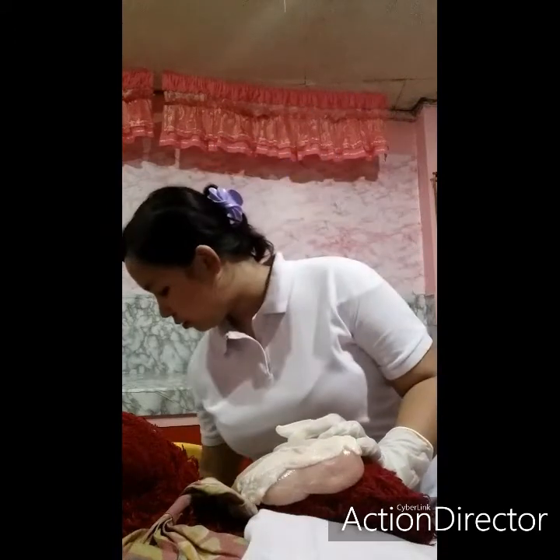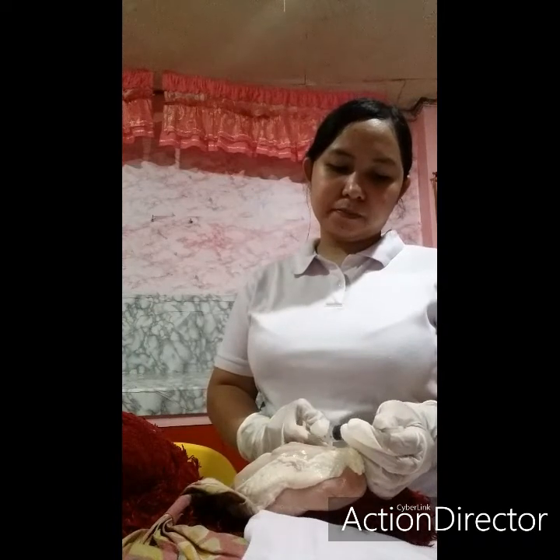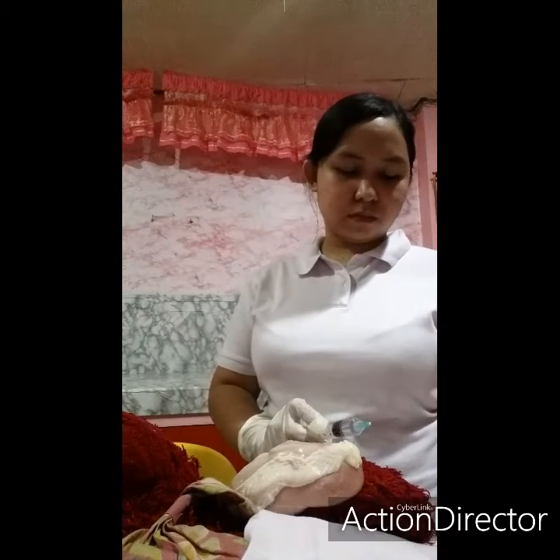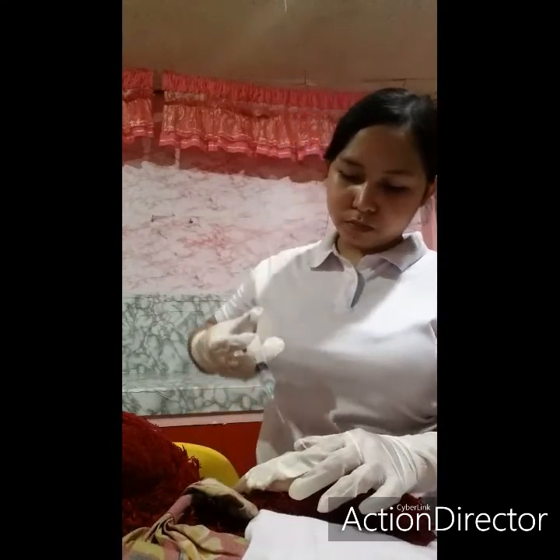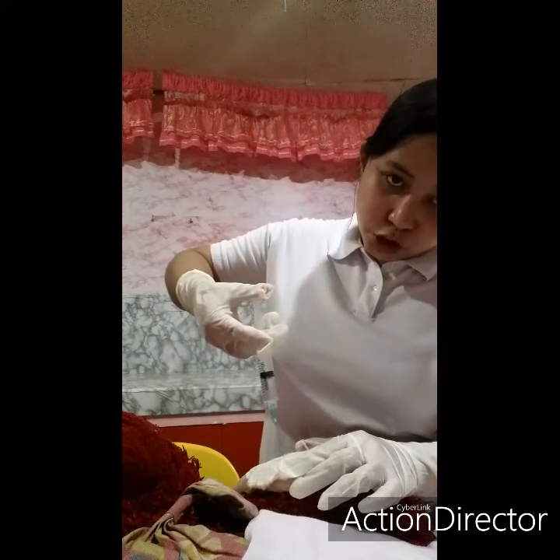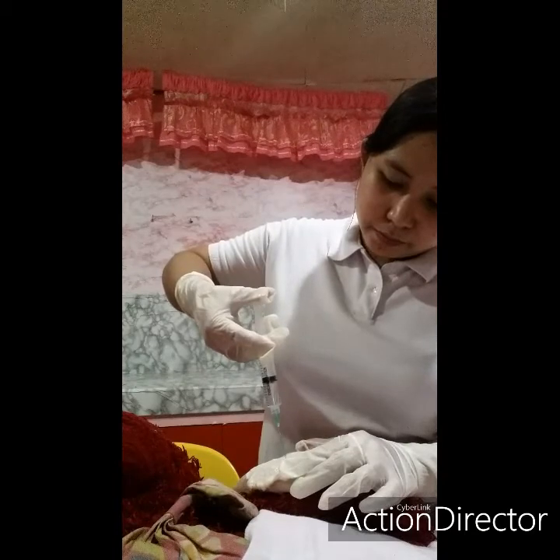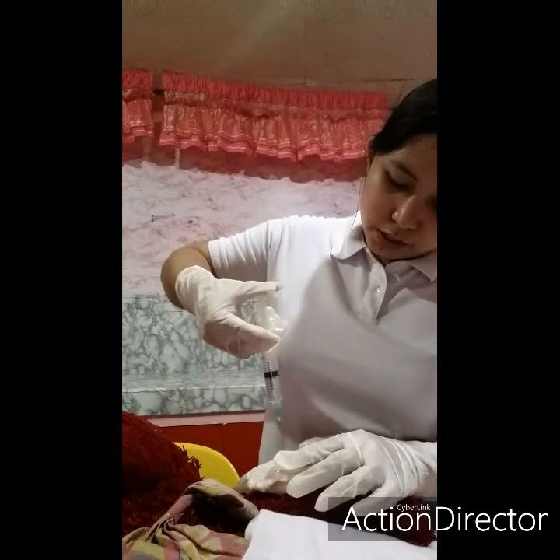And then, prepare the injection. Uncap. Then, inject at a 90 degree angle.